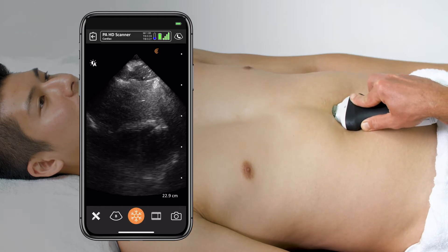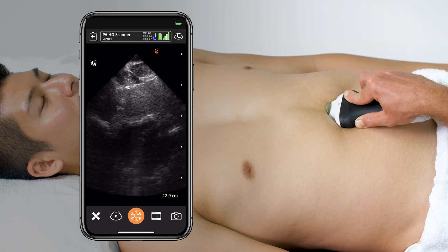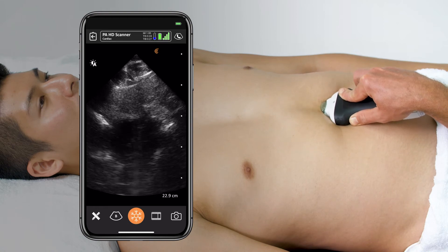Start applying pressure and moving the transducer up towards the diaphragm, keeping it flat as you go.